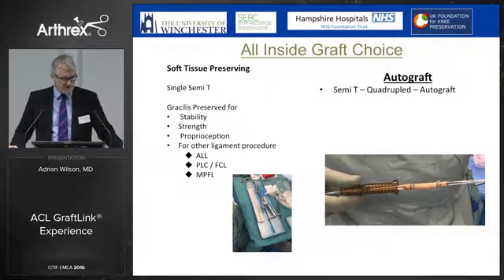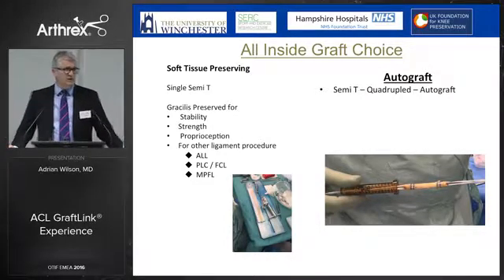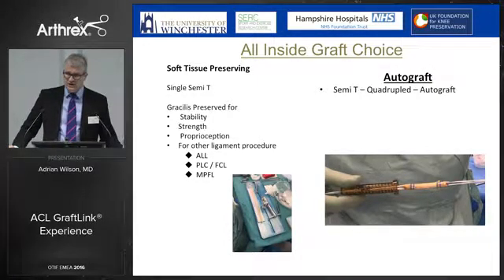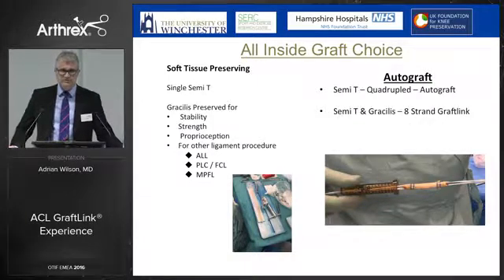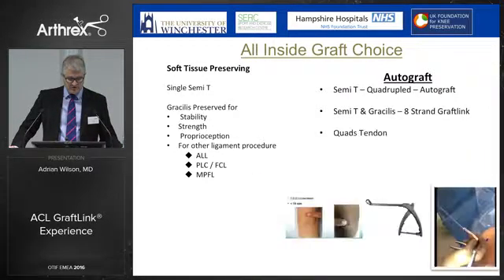So we take a single semitendinosus, and we can leave the gracilis for proprioception and strength and so on. It's an important medial stabilizer. But also, more and more now, we're learning about these new extra-articular procedures, particularly the ALL, and by just using the semi-T for our ACL, we keep our gracilis for these additional procedures if necessary. We usually use autograft, a single quadrupled semitendinosus, but in the presence of a small graft, we can combine the gracilis and the semitendinosus to make a larger 8-strand graft.